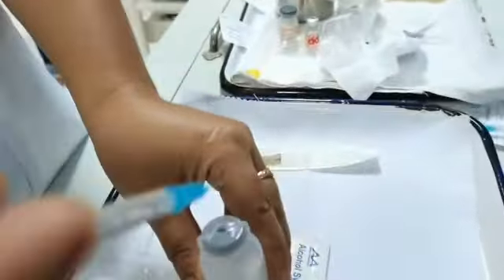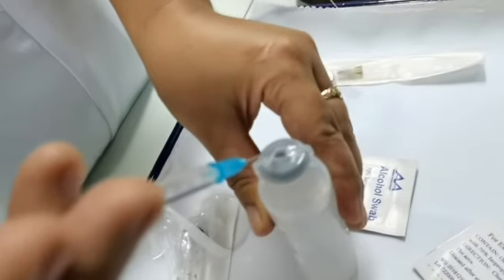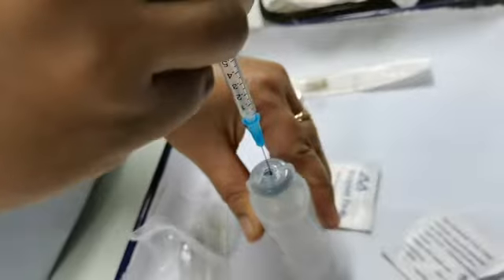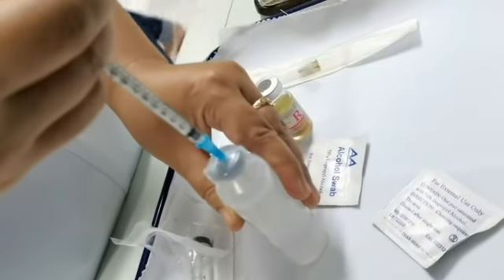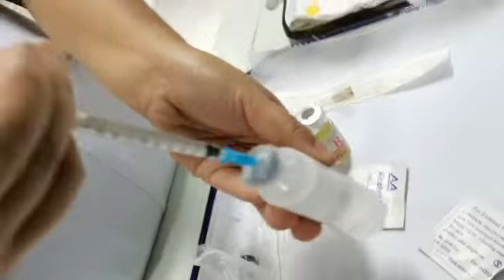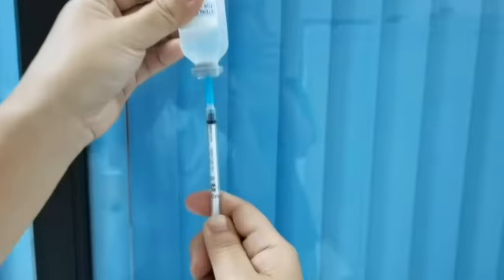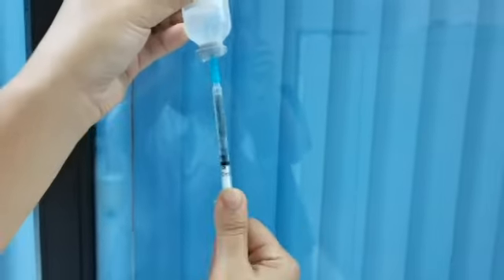Then inject the needle, at first with a slant position, but later on like this. Inject, and then you move the plunger down, then invert. Do like this, still holding the plunger, and get 0.9 ml of distilled water.